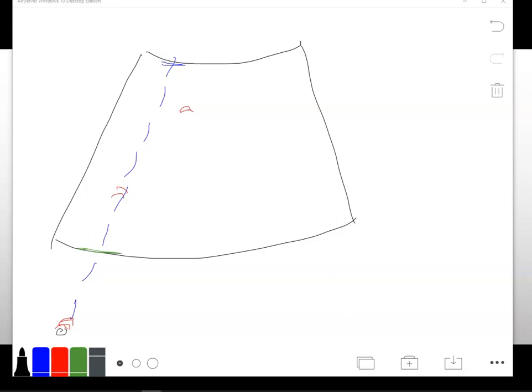So instead of being a structure down here, it's going to get to the transducer as if it was in the next scan line from a structure here. Okay, and so then it's going to keep returning to the probe and give us a false image at this point.